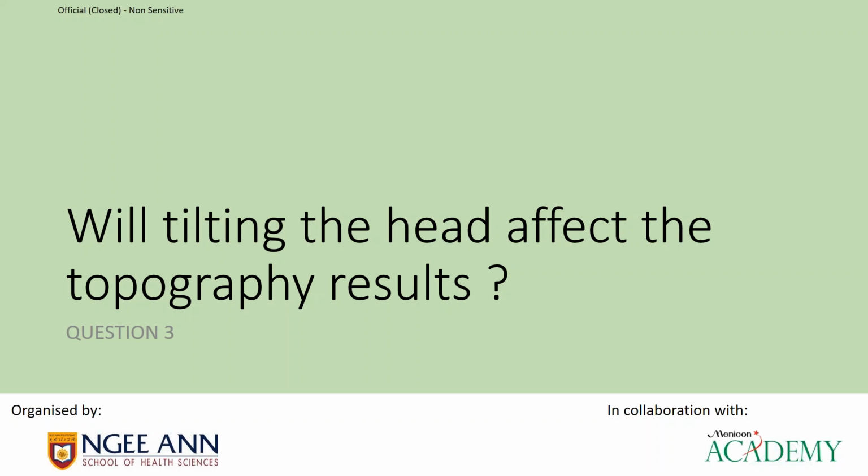No, so okay. Of course, tilting of the head is improving, especially when you have someone with eyeballs deep in the orbita. What you can do is put the chin rest higher, so you get the head up, and of course tilting. Do everything that is necessary to get a situation where you have as much information as possible, covering as much space of the eye as possible, because the more you have that, the less we have to assume something.